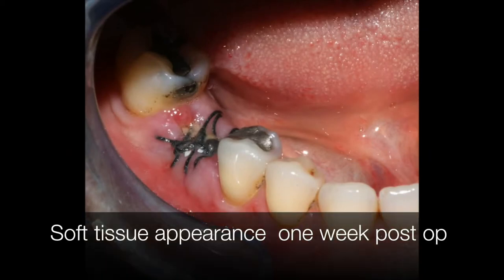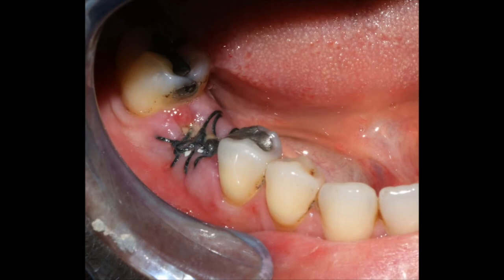That's how it looks 7 days post-op. You can see the proliferation of the soft tissue and the resorption of the collagen sponge.